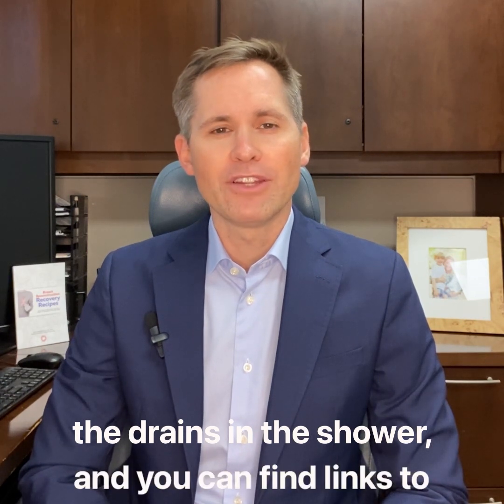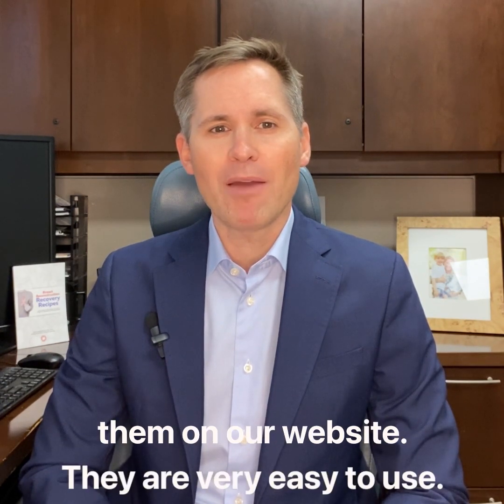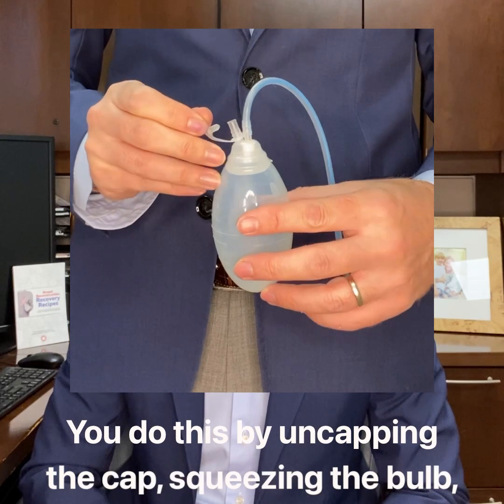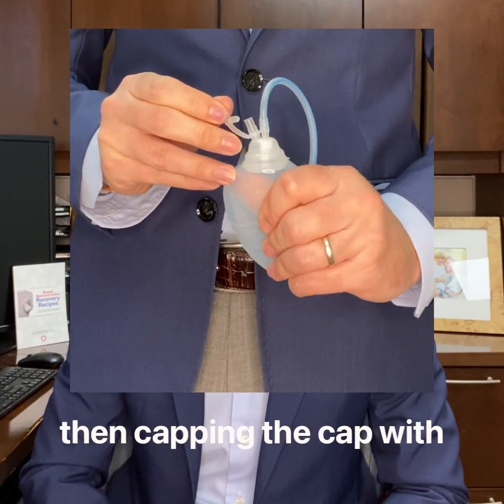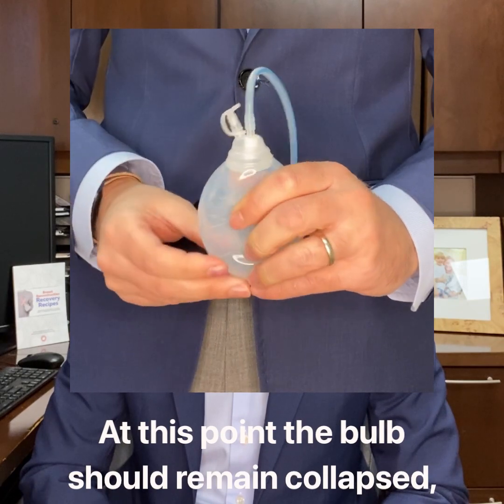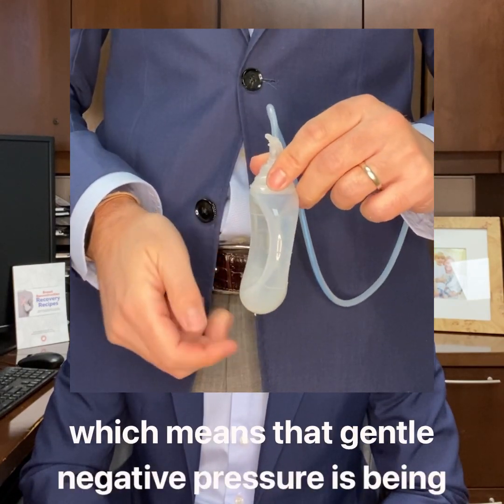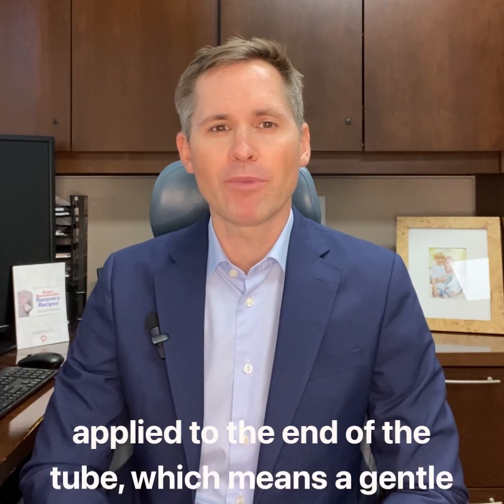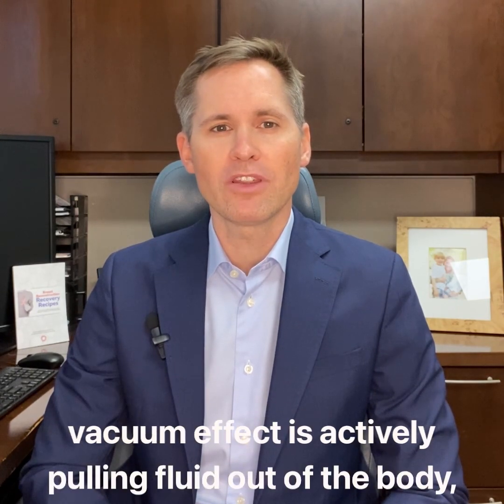They are very easy to use. Please keep them capped on suction at all times. You do this by uncapping the cap, squeezing the bulb, then capping the cap with the bulb squeezed. At this point, the bulb should remain collapsed, which means that gentle negative pressure is being applied to the end of the tube, creating a gentle vacuum effect that is actively pulling fluid out of the body, through the tube, and into the collection bulb.